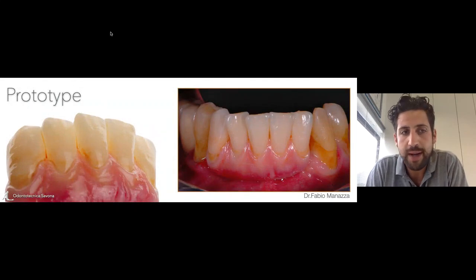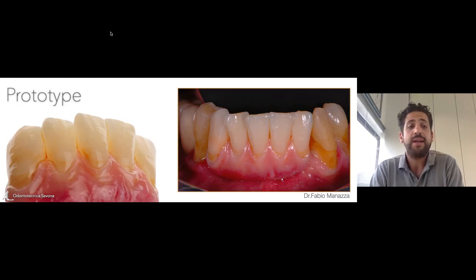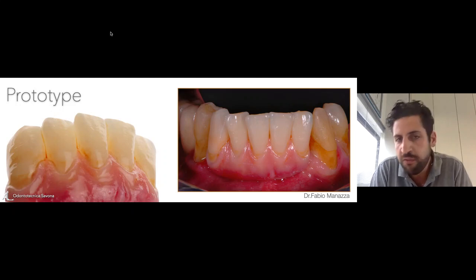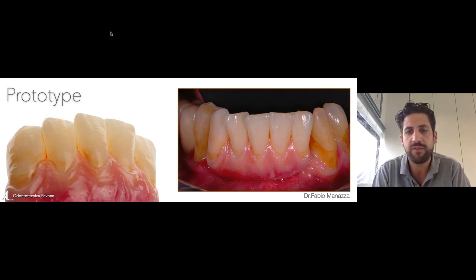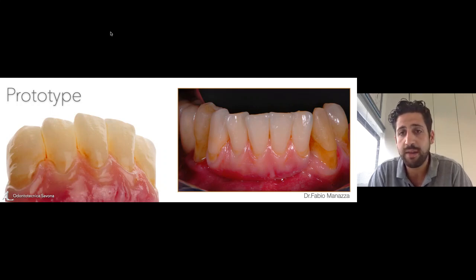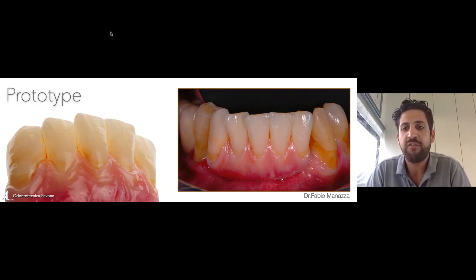We made a really nice prototype to see if everything was in the right direction. And for my personal opinion, it's really important to make the prototype because, for example, in this case, we made this prototype and we can see, okay, the gingiva is quite good. The color of the violet pink is really nice. But if we concentrate on our teeth, we can see immediately the canine that we restored is too light. So we already had the information to make it a little bit darker in the definitive.